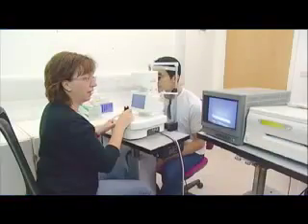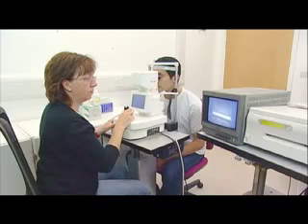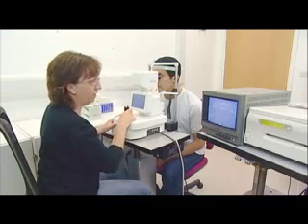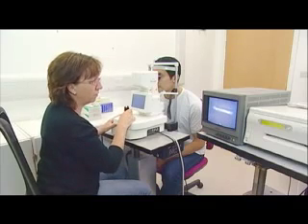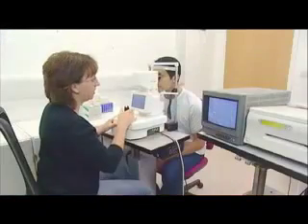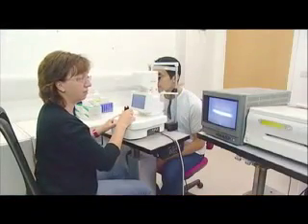Measurements may be made on screen, on the printed page, or after capture using image analysis software. This is video meniscometry, which is one of the few ways that we can actually quantify this feature of the tear film.